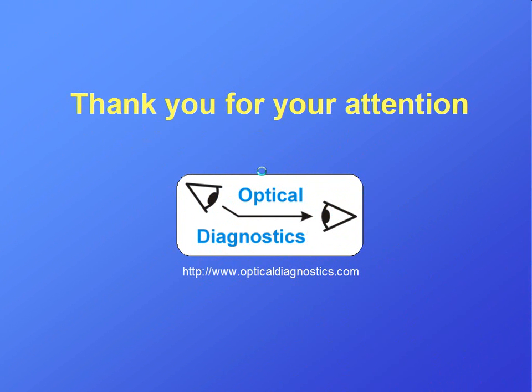You have viewed a brief demonstration of the Aniseikonia Inspector software. Thank you for your attention.